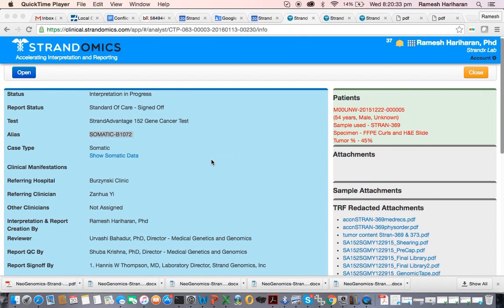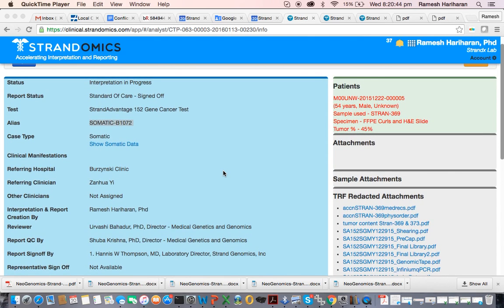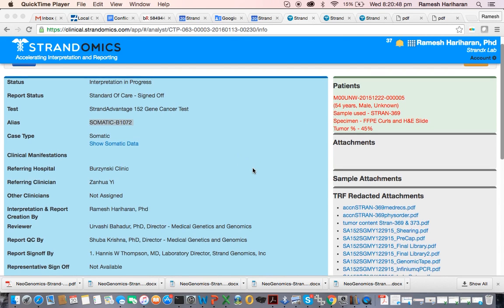This is a quick demo of the Strandomics system, which we use at Strand Life Sciences to do all our reporting of clinical tests. We run a fairly large number of clinical tests spread over rare diseases and somatic cancer. And this demo will cover the somatic cancer piece.